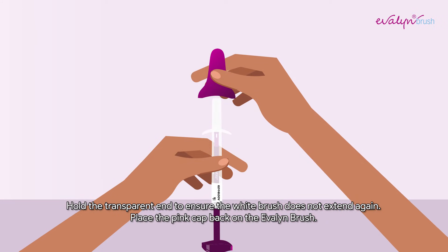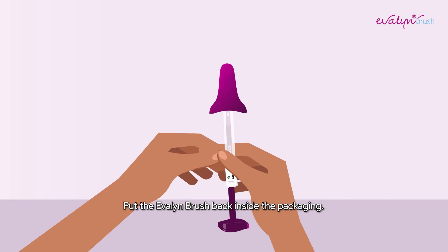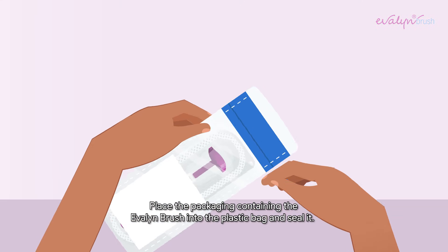Place the pink cap back on the Evelyn Brush. You will hear a click when it is properly in place. Put the Evelyn Brush back inside the packaging. Place the packaging containing the Evelyn Brush into the plastic bag and seal it.